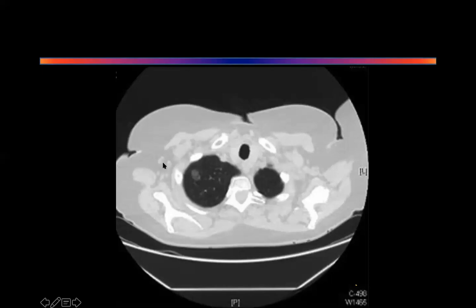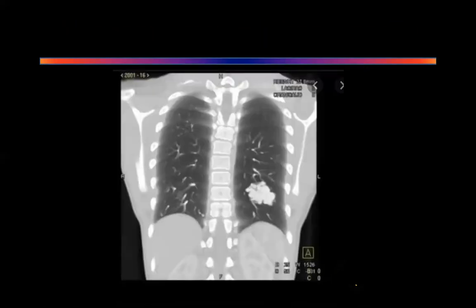If somebody asked me to describe this, I would say this is a CT scan of the lung with evidence of a lesion in the right upper lobe. Looks multi-lobulated, looks ground glass. Rest of the lung appears to be normal. I would like to rule out malignancy in this patient. Okay, that's the answer. Very well done. Okay, come on next.